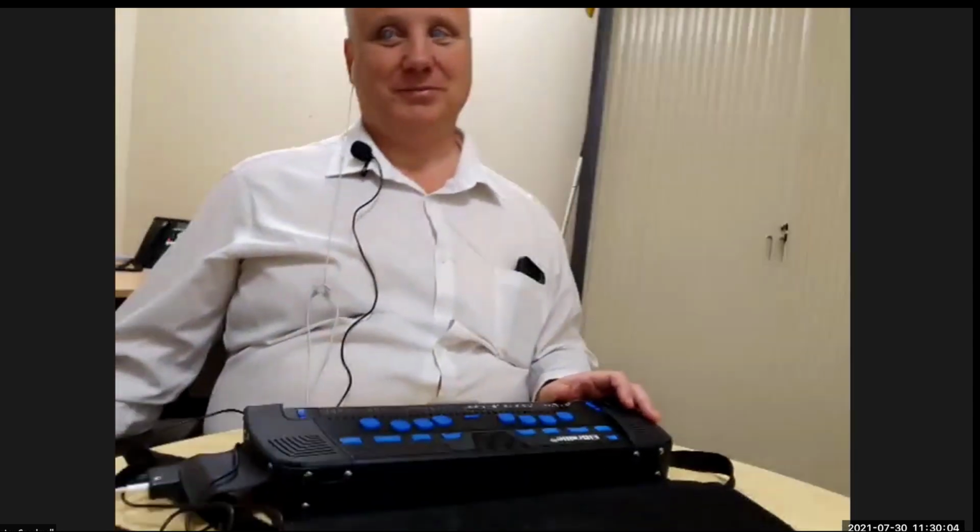So, who would actually use one of these things? What would you use it for? Well, as Damian pointed out a few situations earlier where it would be useful, presentations, in meetings, things like that. Even in a meeting, you could quite easily have your laptop on one side of the room and your Braille display on the other, because this thing also does have Bluetooth connections. So if you wanted to do that, you could sit your laptop somewhere, have the Braille display in front of you. You won't be taking up too much space and looking at people over a screen, or they won't be looking at you over a screen, and work it out that way.